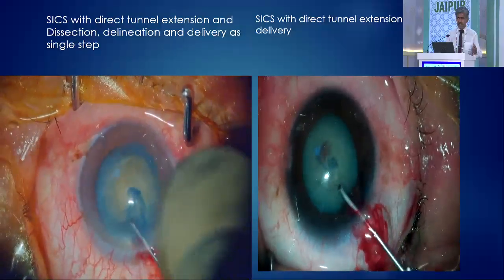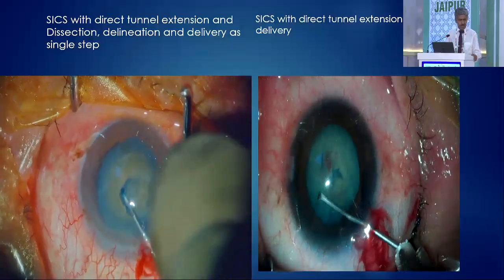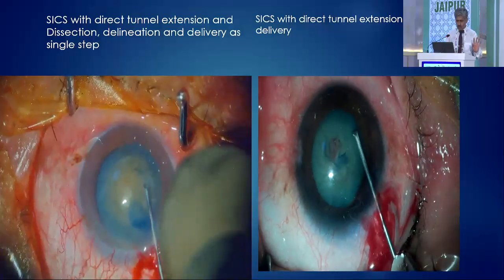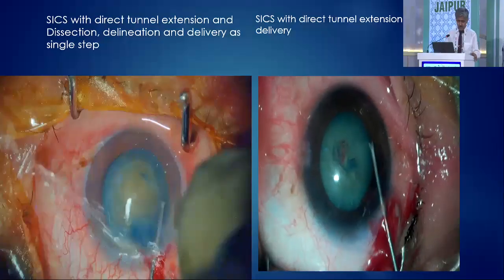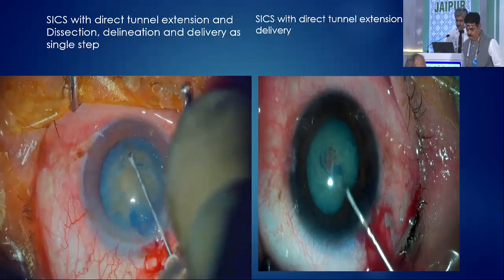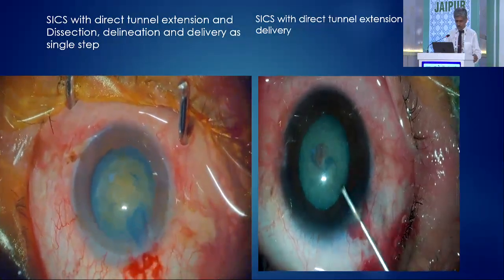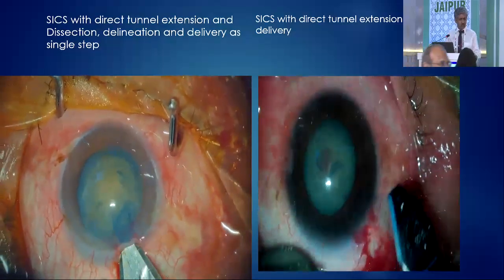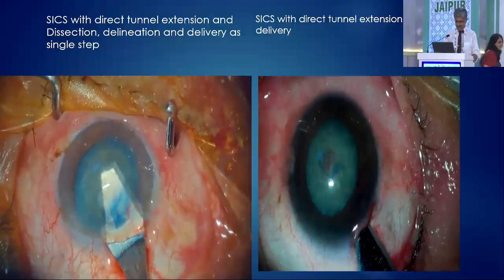In this case, as the incision is posteriorly placed, there is some bleeding, but not even a single drop goes in. One would think there might be a lot of bleeding that will enter the anterior chamber. As you can see, the capsulorhexis is completed. Two or three extension cuts were given, and a larger rhexis was made.